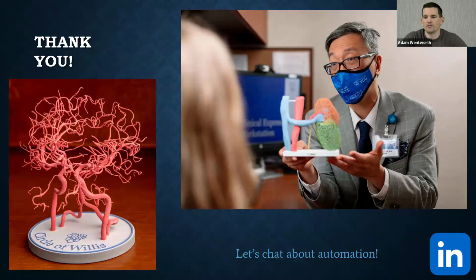Personally, I've found that doing those pre-processing steps, at least in our software, is very cumbersome. It's very slow and not always needed. We haven't found a need to really do that for a large amount of our applications. It could save file size, but I don't think that's necessarily a driver for us to do that. We essentially are relying on good reconstructions of those raw images to have IMAR, to have soft tissue kernels, things that just make the segmentation work, rather than worrying about it after the fact.